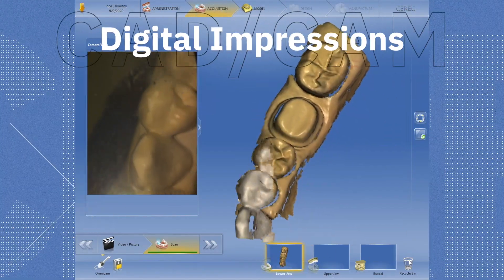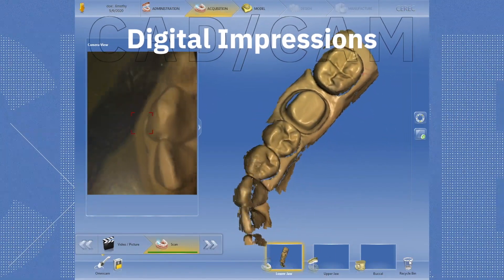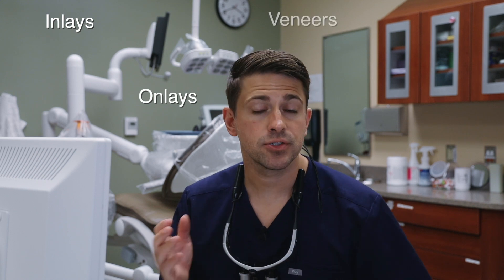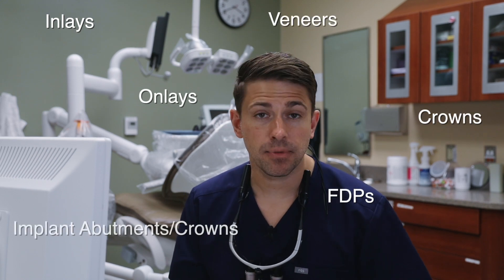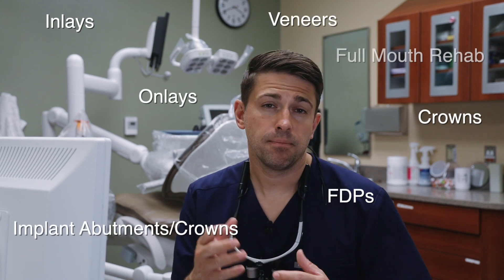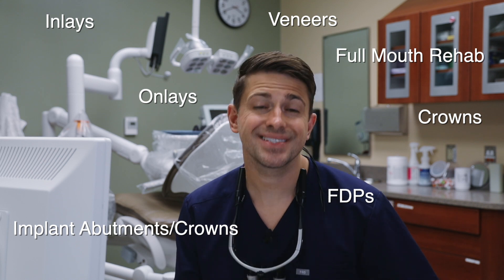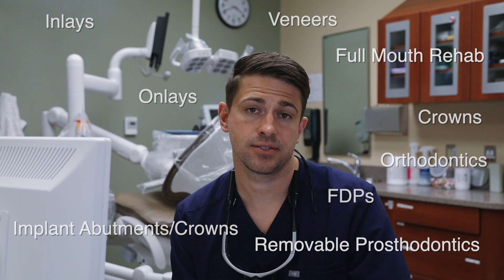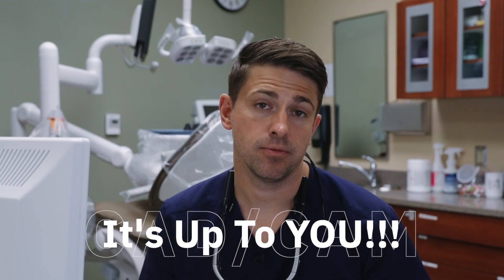And if you do not want to design and mill your own restorations, you can send digital impressions to a dental lab who can then use those impressions to do whatever you desire. CAD CAM technology gives you options to fabricate inlays, onlays, veneers, crowns, FPDs, implant abutments and crowns, complete full mouth reconstructions, and can even be useful in orthodontics and removable prosthodontics as well. The extent to which the provider wishes to use CAD CAM is up to them.